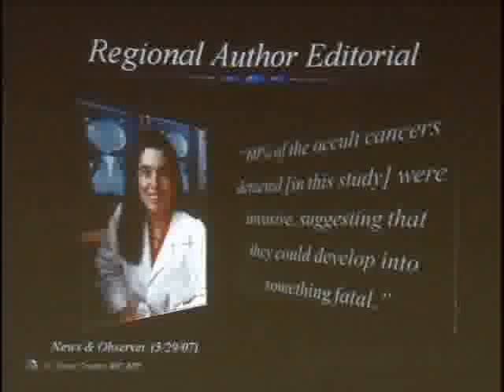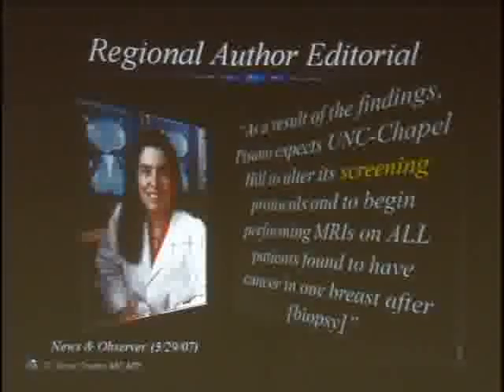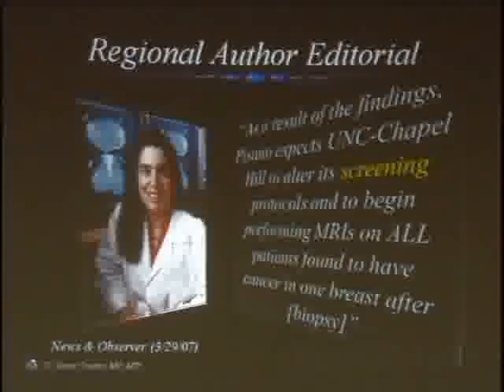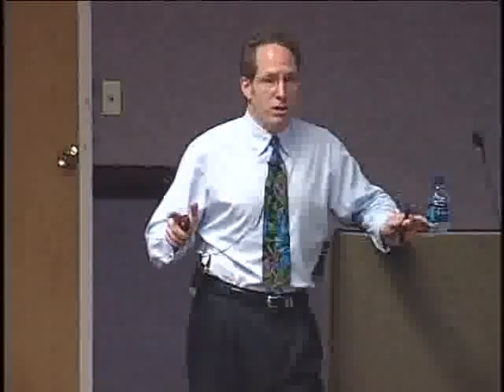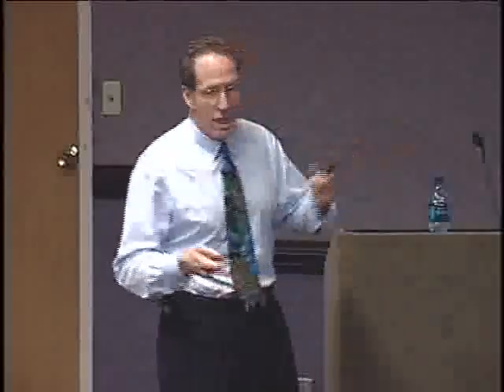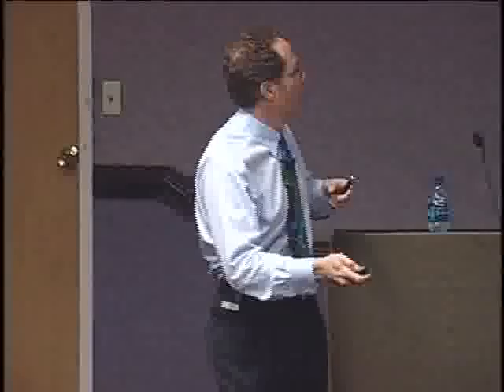She said 60% of the occult cancers detected in this study were invasive, suggesting that if we had not found them, they would have become clinically significant. Because of these results at UNC, they were going to alter their screening protocols to begin performing MRIs on all patients who have had a biopsy that's positive. Wow! I don't think you can appreciate what that means. That's hundreds of thousands of patients in the United States just got their whole workup changed. It's a big deal for somebody to say this. So stage one, screen the other. Every time, do both. Don't ask for one.